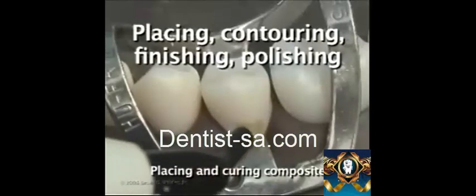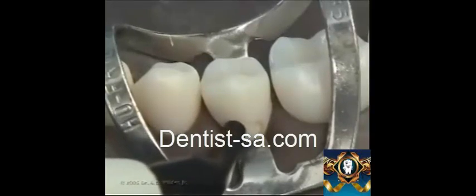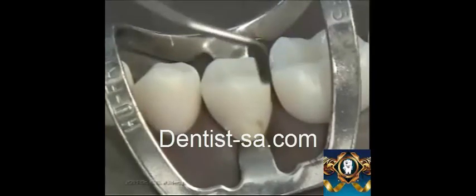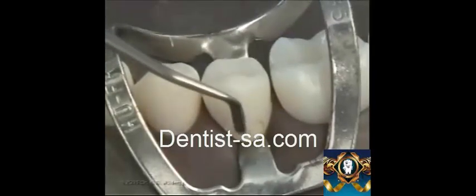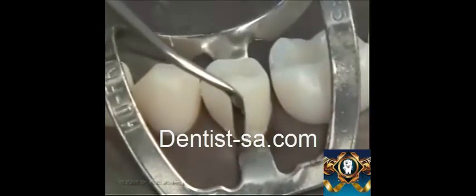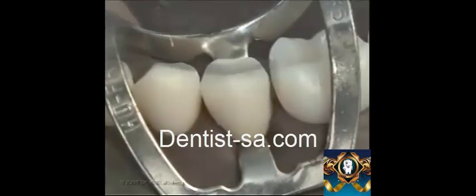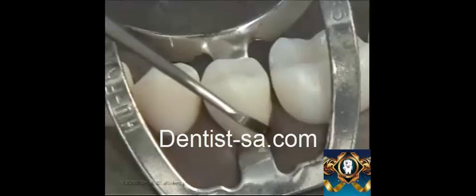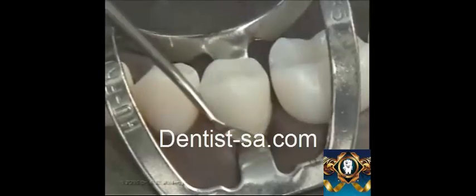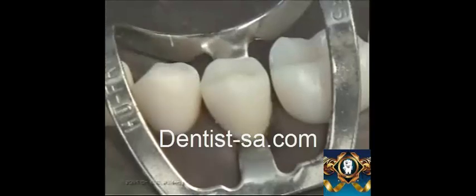Composite placement is usually done in incremental layers. The first increment is placed and inserted into place using a plastic filling instrument or a composite filling instrument into all the line angles so that no voids are present. The cavity insertion with composite is done in a thorough, diligent manner and it is contoured properly so that the finishing procedure done later will be minimized. Any excess is also removed.